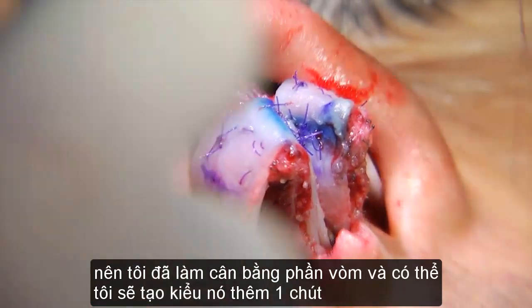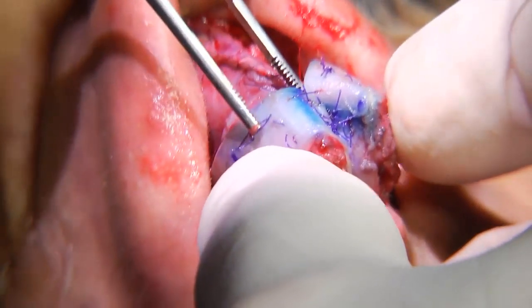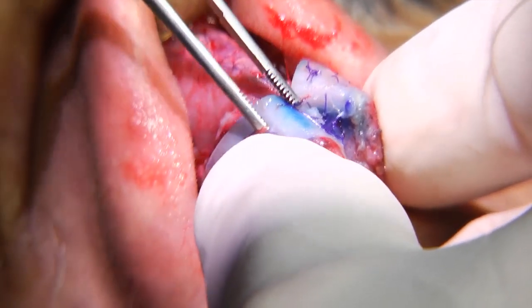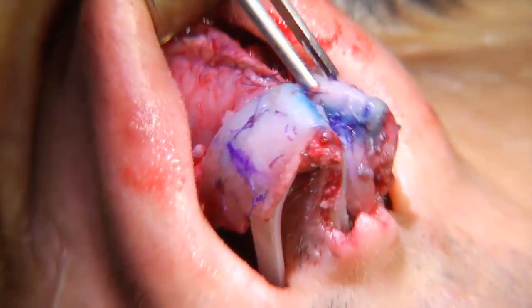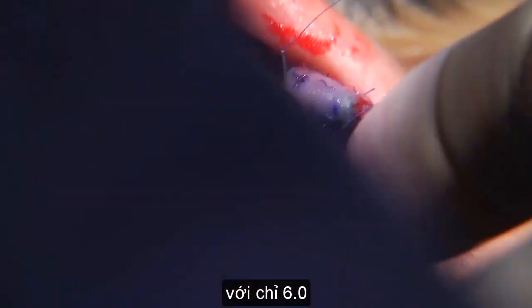So I'm equalizing my domes and maybe I can fashion this a tiny bit better. Give me 6-0. I need this just a little bit narrower with a 6-0.